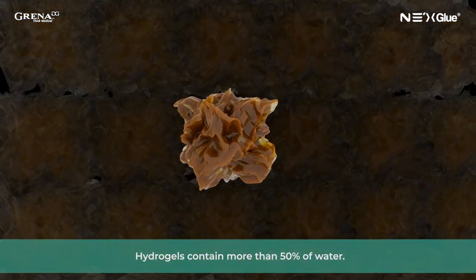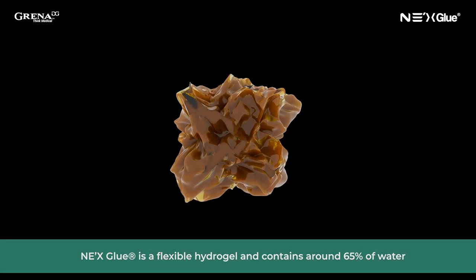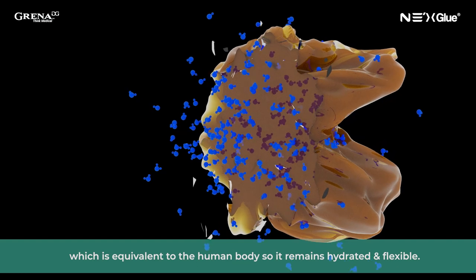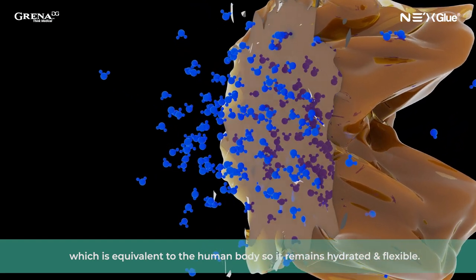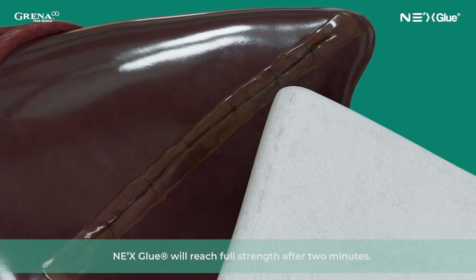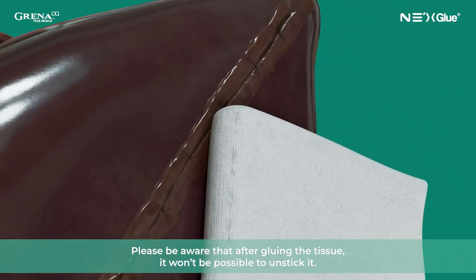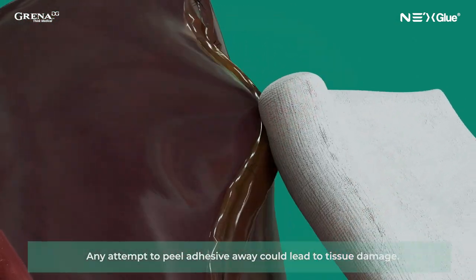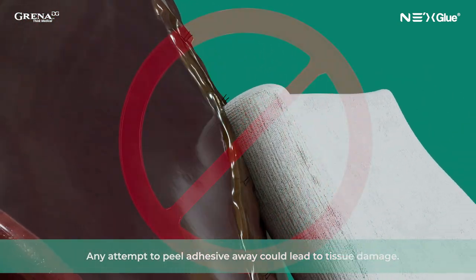Hydrogels contain more than 50% water. NexGlue is a flexible hydrogel and contains around 65% water, which is equivalent to the human body, so it remains hydrated and flexible. NexGlue will reach full strength after two minutes. Please be aware that after gluing the tissue, it won't be possible to unstick it. Any attempt to peel the adhesive away could lead to tissue damage.